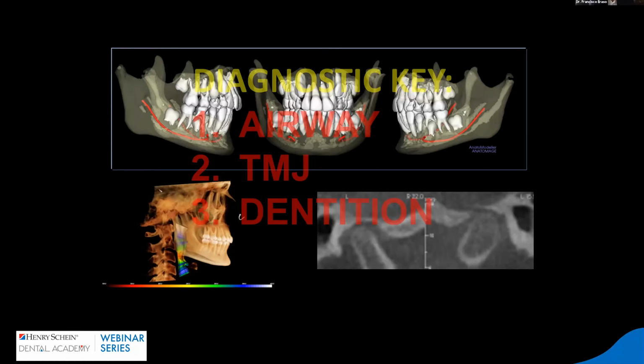A lot of people ask me, what happened here, why is this molar not moving? Pneumatization of the maxillary sinuses, okay? The floor of the maxillary sinus pneumatized into the space between the first molar and the premolars, and you want to move the molar mesially, for example. There's no way you can move that molar mesially. Suddenly you see tipping of that crown, and you cannot correct that. You take the x-rays and see the reason: the pneumatization of the maxillary sinus. Moving the roots through the air of the maxillary sinus is very difficult, and it's going to take time.